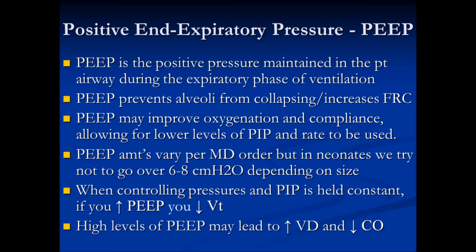PEEP may improve oxygenation and compliance. That is why when patients have low compliance or stiff lungs, we can incorporate higher levels of PEEP than those babies who don't have problems with compliance.